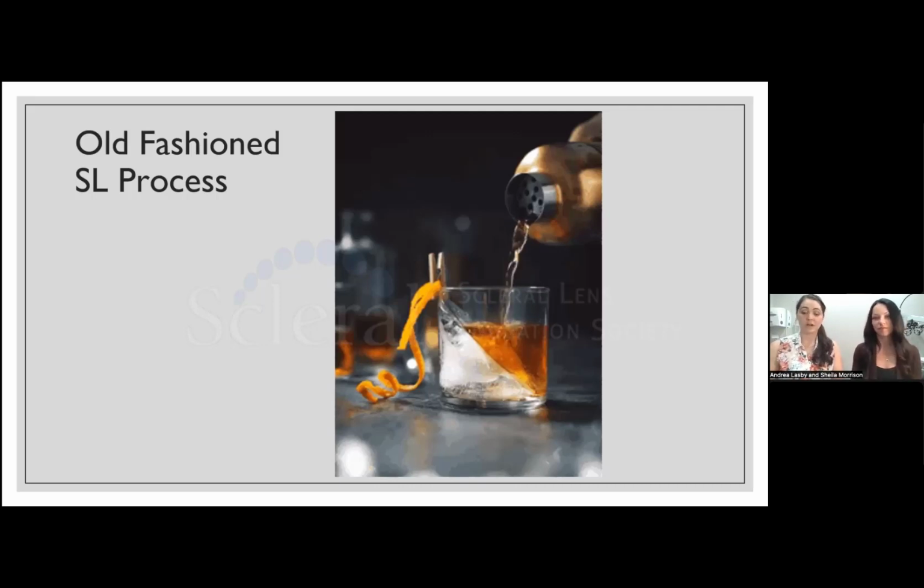Both. So what I'll do is I'll grossly put a huge blue light over everything, and I'll just quickly look for clearance all around. I'm looking for touch. Is there limbal clearance all the way around? And then I'll put on the white light and bring that beam down, at about a 45-degree angle or so. Then you can really measure, especially if you know the thickness of the cornea and the thickness of the lens you're dealing with, and see where that fluorescein is getting a little tight.